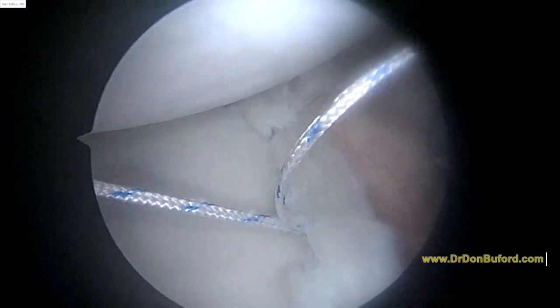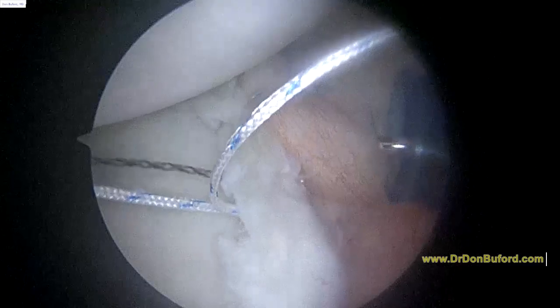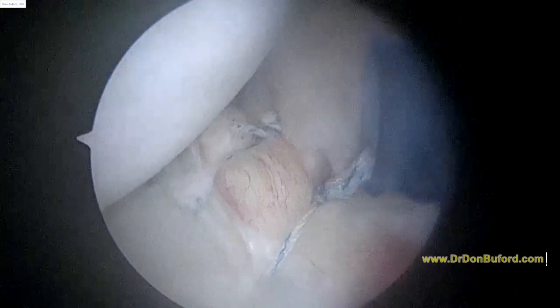That looks like a good shot there. Okay, I'll show you some more in a minute. Okay, so what we've got here is three anchors and three very strong sutures holding down and reconstructing this posterior shoulder. I apologize, I'm getting a little foggy. I'm going to try and clear up the fogginess in the camera and get a better picture. I guess that's a little better picture.